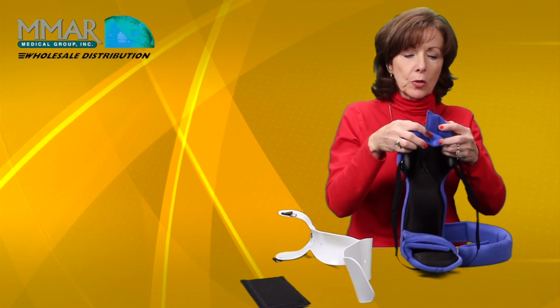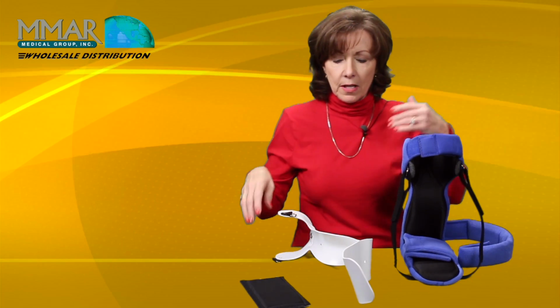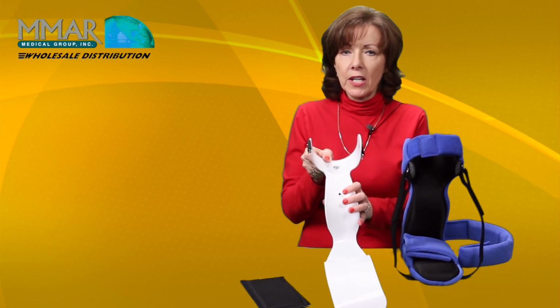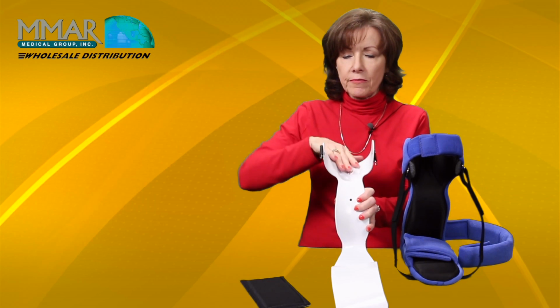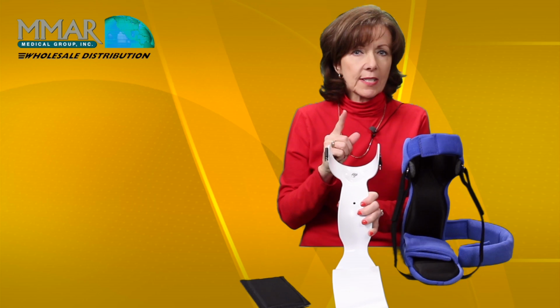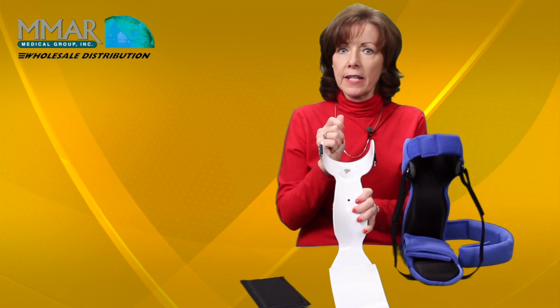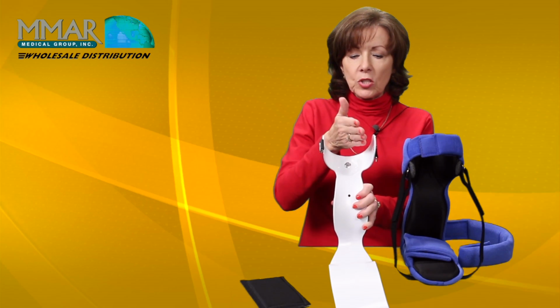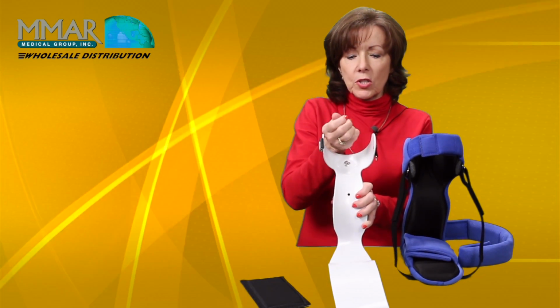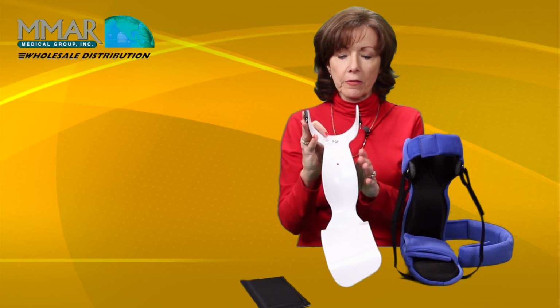Okay, this is going to go around the calf, around the lower leg. If you have a larger calf, this is very easily heat moldable, again with a heat gun. And a heat gun can be purchased at any place that sells paint, your Lowe's, your Home Depot, hardware stores. It's just like a hairdryer on steroids, but it's very hot. Wear gloves when you use them. But you heat mold a surface, you don't just hold it on a spot, and you would just gradually bring this out to the circumference you need.